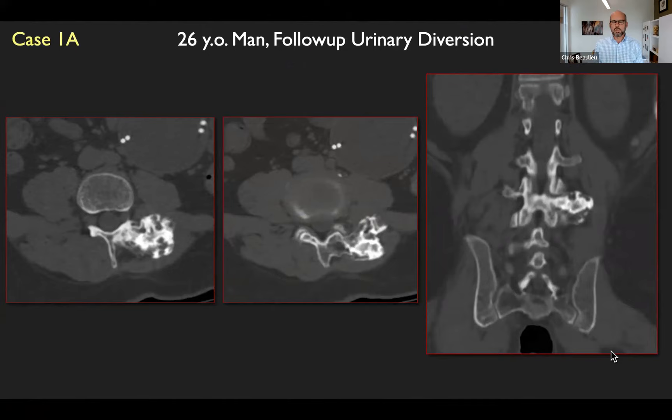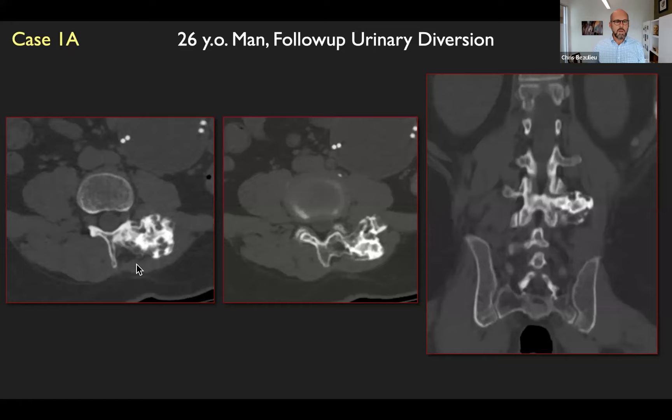We'll start with case number one. I'll give you a few seconds to look at the images and think about what you might do or say in a case like this. This is a 26-year-old young man with urinary diversion. You can see the conduit with post-operative changes in the mid-abdomen. And then in his spine, there's this large bony structure protruding off of the vertebral body on these axial images and on this coronal image. Does anybody want to shout out what you think this might be?